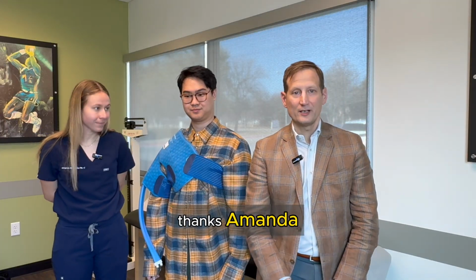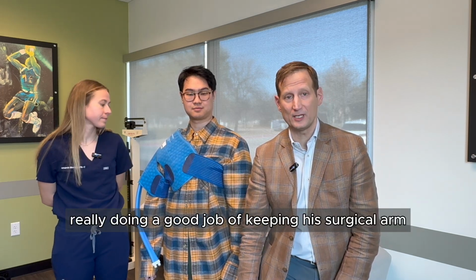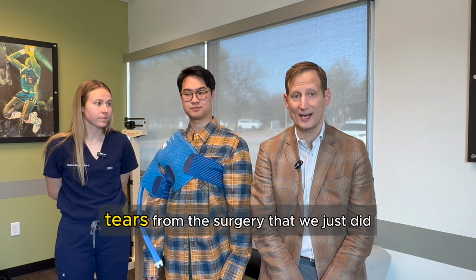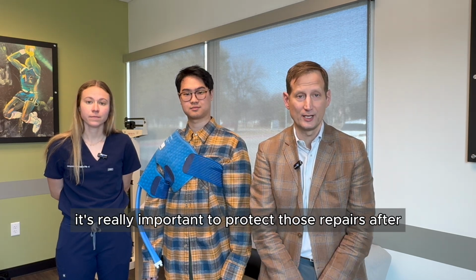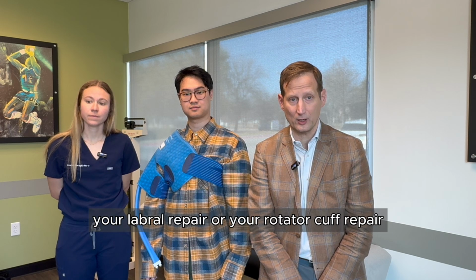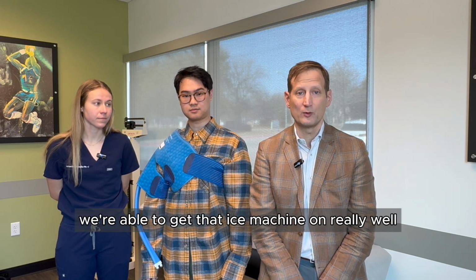Thanks, Tuan. Thanks, Amanda. As you can see, Tuan was really doing a good job of keeping his surgical arm relaxed and comfortable to help prevent any sort of tears from the surgery that we just did. It's really important to protect those repairs after either your shoulder replacement, your labral repair, or your rotator cuff repair. And we can see that with Amanda's help, we were able to get that ice machine on really well.